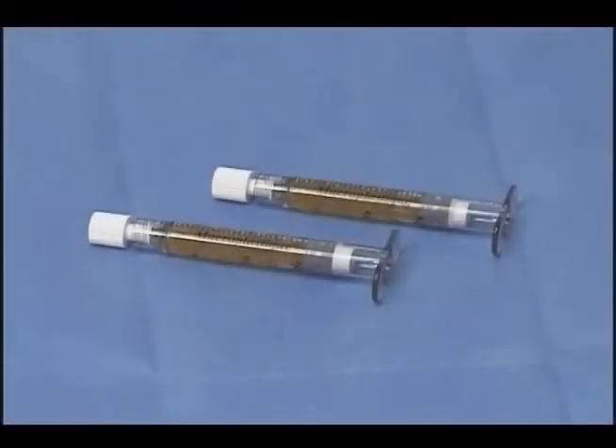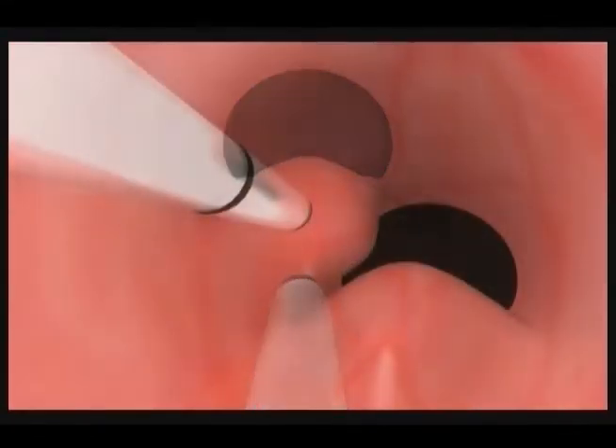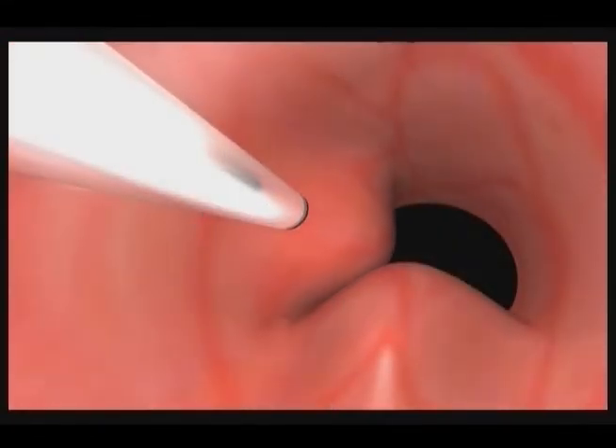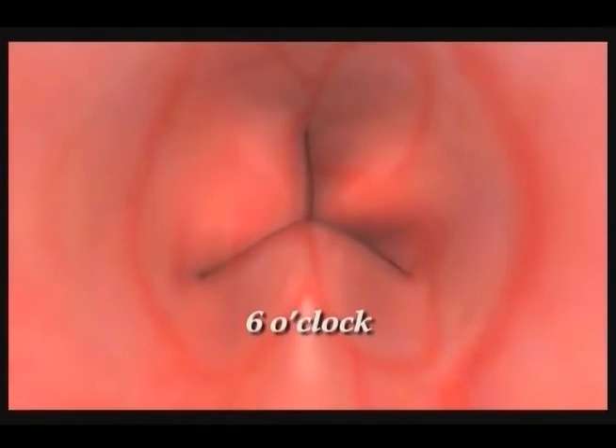Macroplastique is an injectable soft tissue bulking agent. During the implantation procedure, three boluses of Macroplastique are implanted in the submucosa of the urethral wall. These are referred to as the 6 o'clock, 10 o'clock, and 2 o'clock positions.